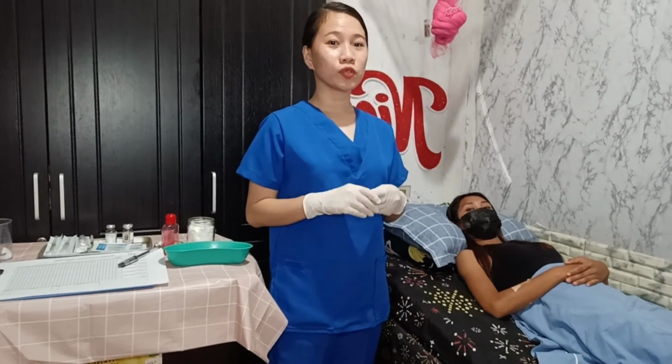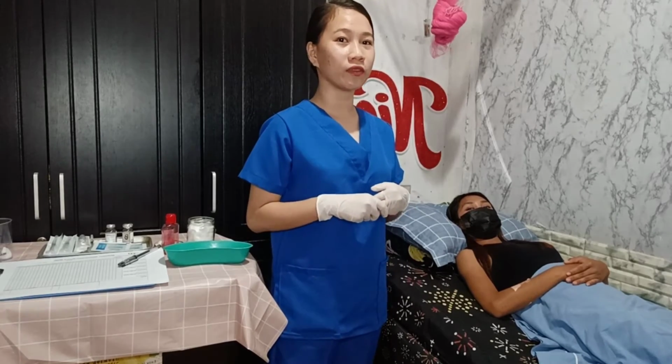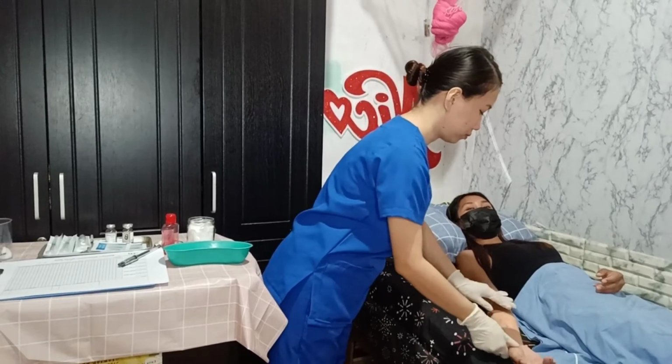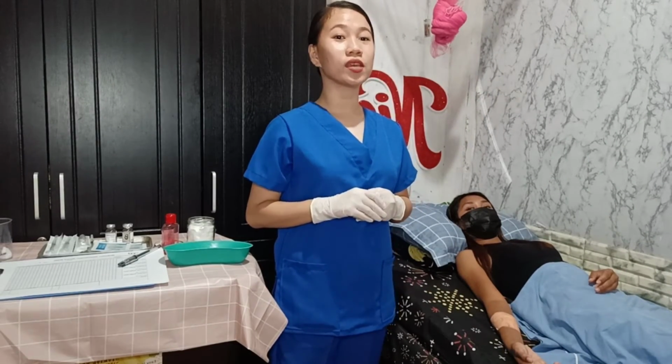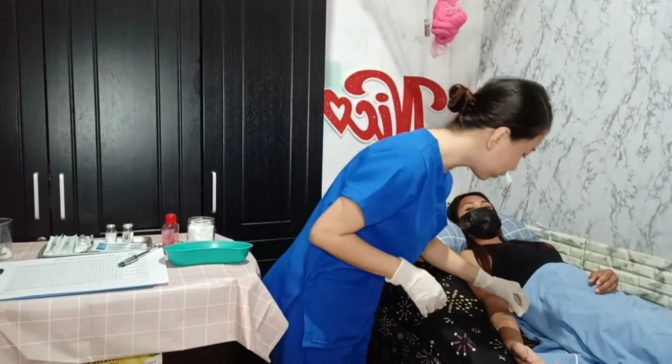So next, position the client's arm so that the elbow and forearm are supported on a flat surface. Cleanse the skin at the site using a firm, circular motion.